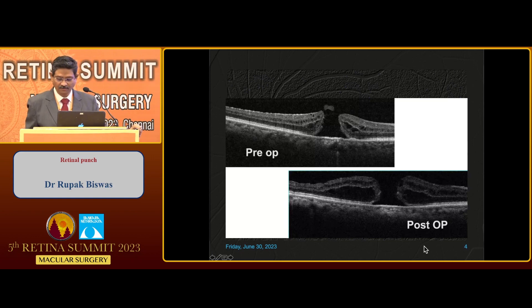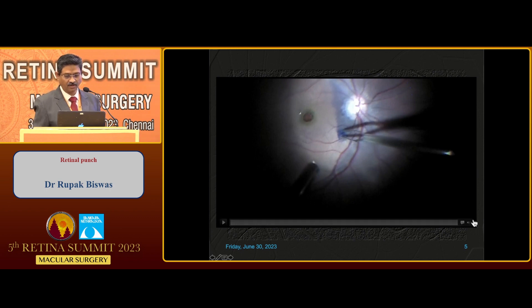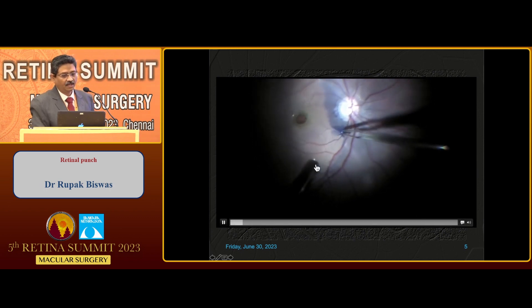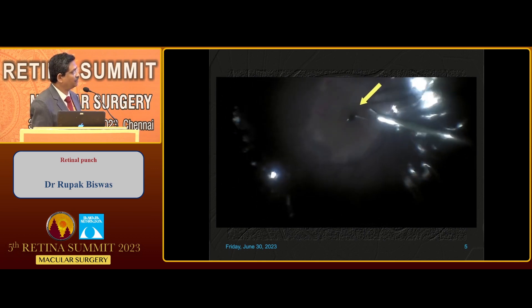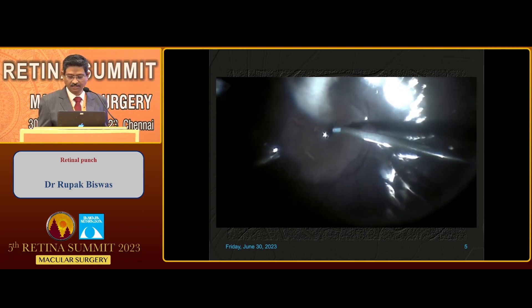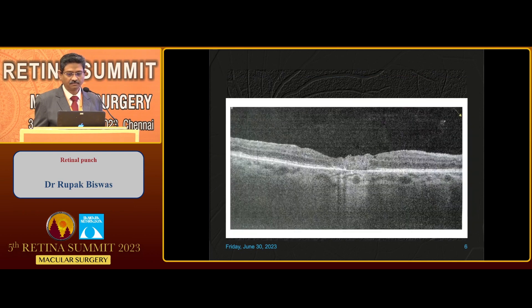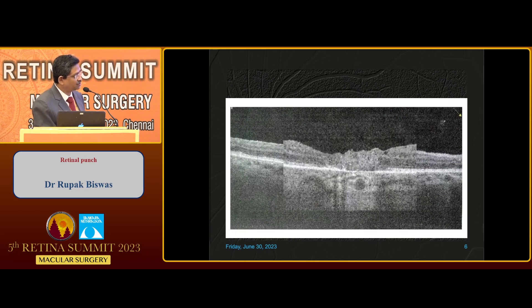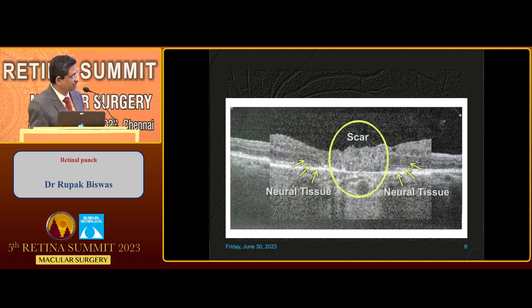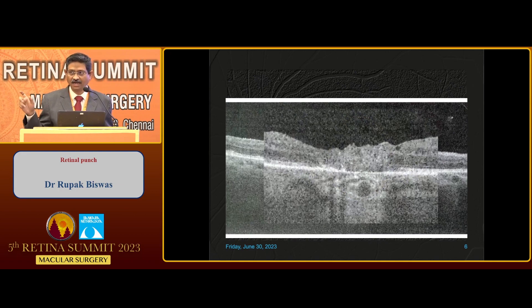This is the pre-op and post-op differentiation. There are multiple techniques that have already been described. When you put a free ILM flap and see the outcome, the anatomical closure is always there. But with high-resolution OCT, you can see the central part is only filled with scar. As Dr. Deidy showed in the last presentation, there was no retinal tissue — neurointegration is a different matter — but at least the anatomical integration was present.